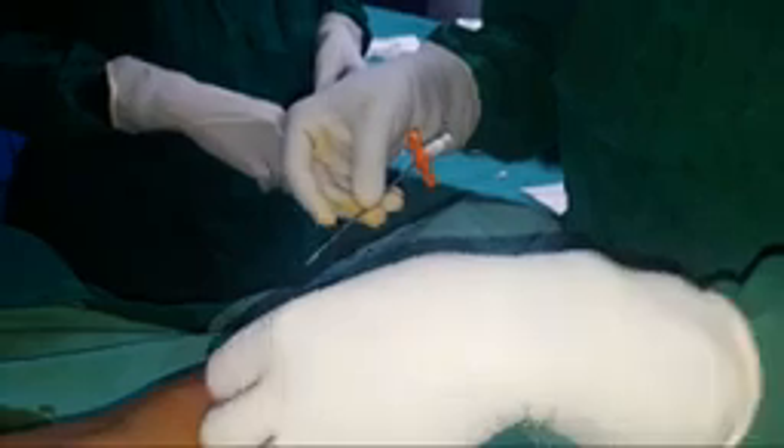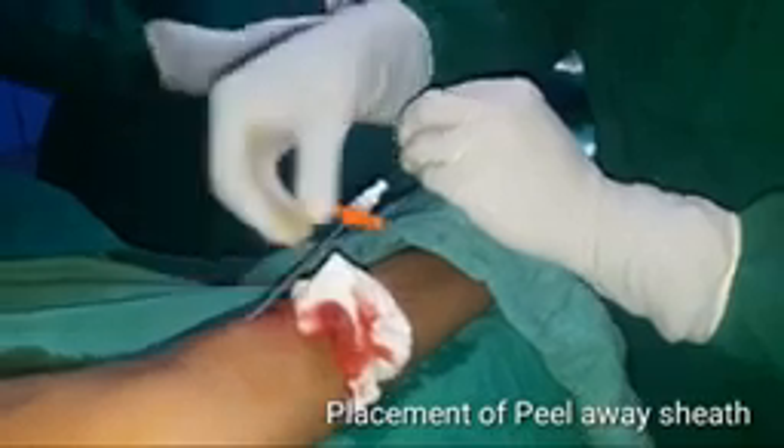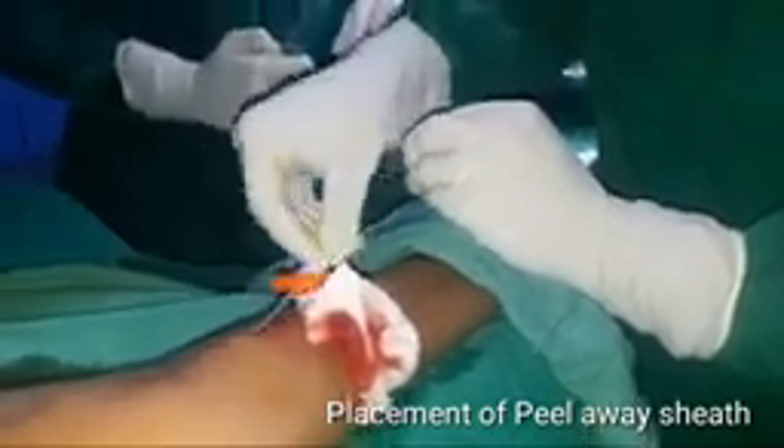I removed the IV cannula and over the wire I am placing the peel away sheath. This will go through the basilic vein and into the vein.